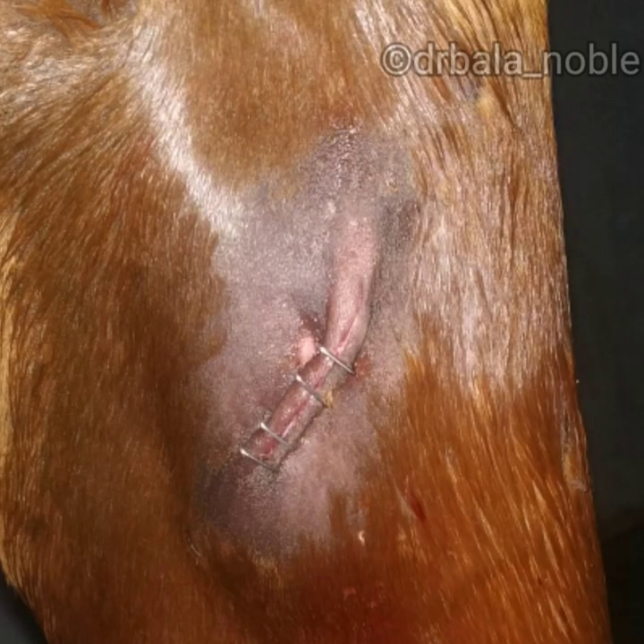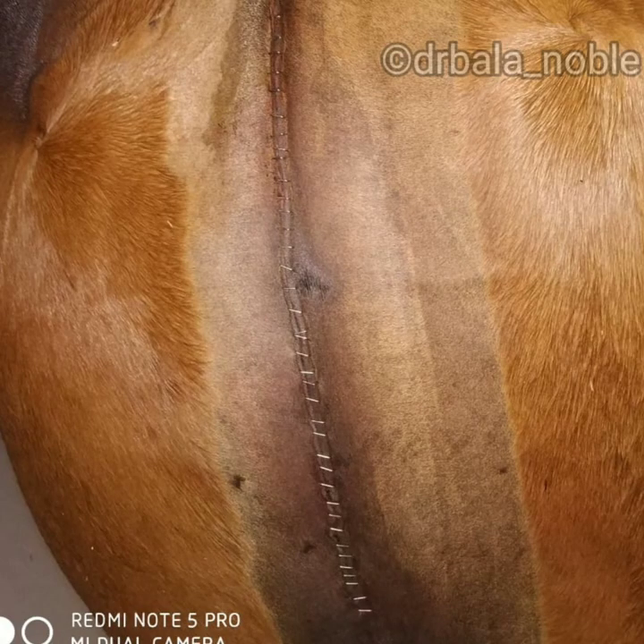The first advantage is quick placement — this won't take much time like suturing. This is an example of a c-section in a horse. It took hardly two minutes to staple this area, but if it was suturing it would have taken at least 20 minutes.